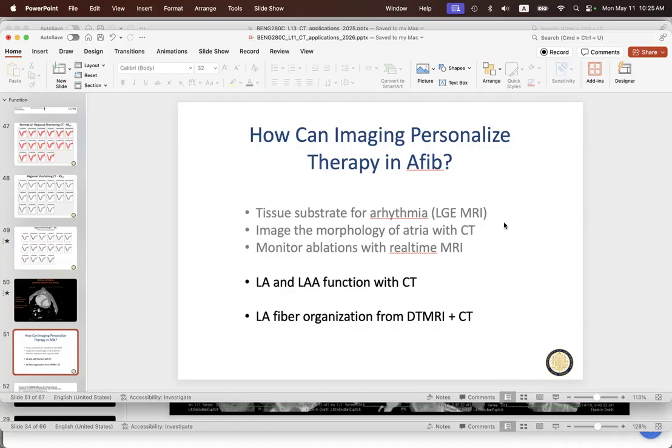This is very useful later after the procedure, if they get an MR, and it's a big deal to get an MR for this. You can look at how the burns have enclosed off the actual pulmonary vein, or if there's a gap in the burn, that's a problem.